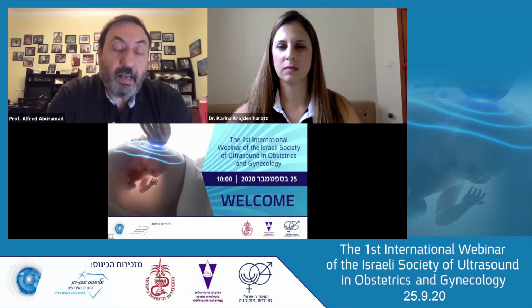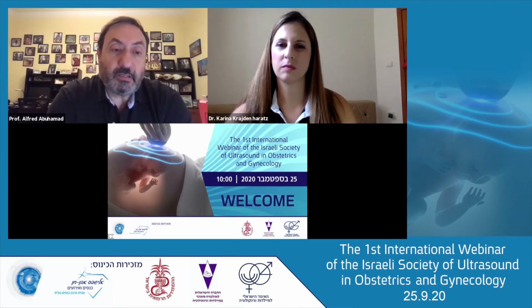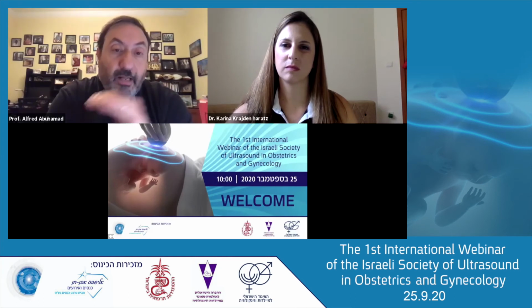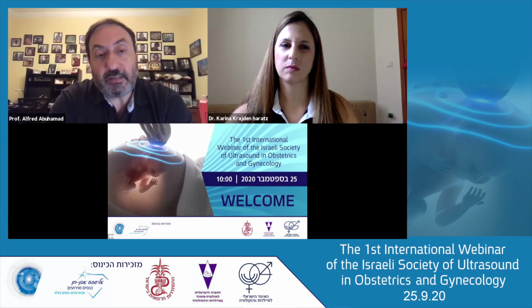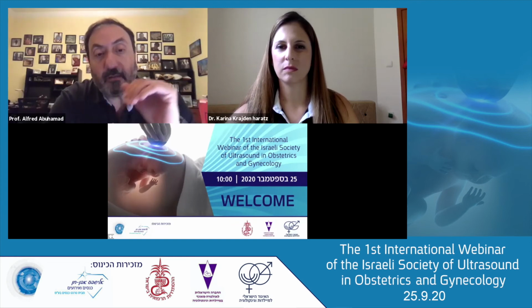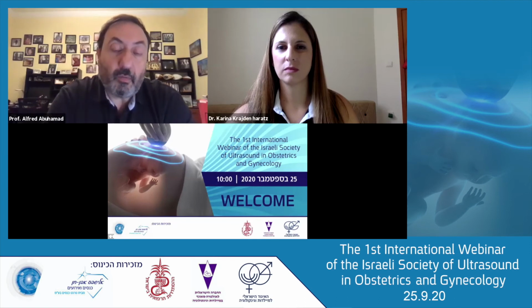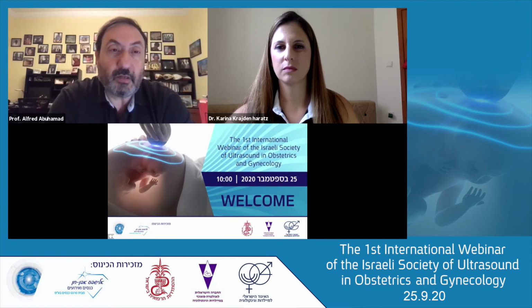The new fetal echo guidelines that were just released by the AIUM and many societies in the United States have added, for the first time, pulse Doppler at many different levels. So it is at the AV valves, and then at the semilunar valves, and then certainly looking at at least one of the pulmonary veins because of the reasons that I mentioned, because of the abnormality in the pulse Doppler when there is anomalous venous return. So color Doppler, yes, all the time.